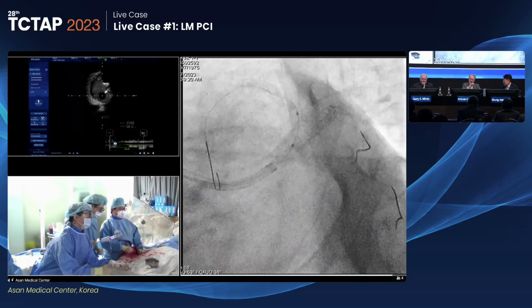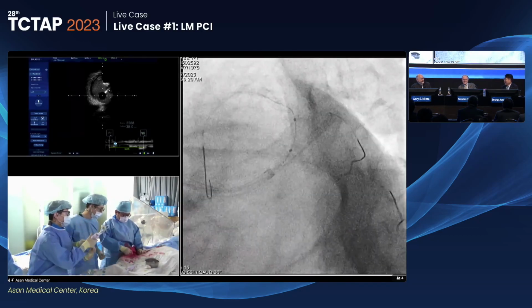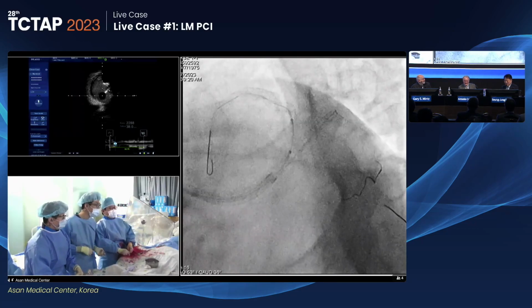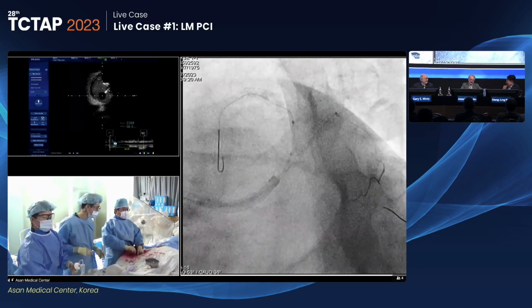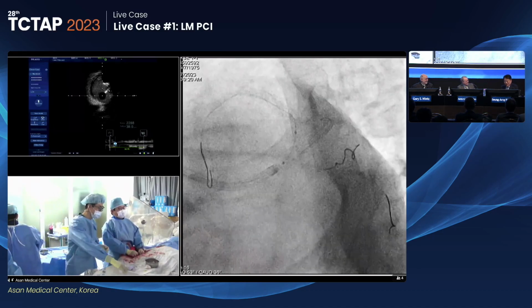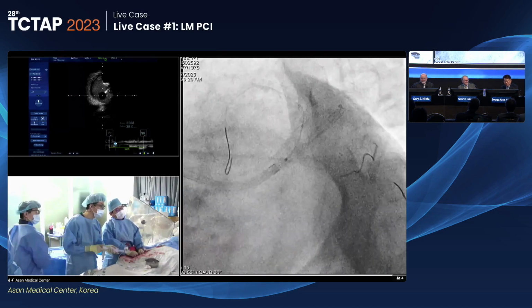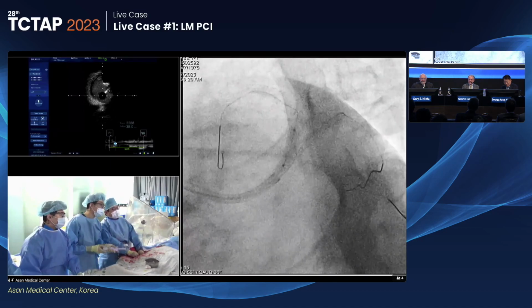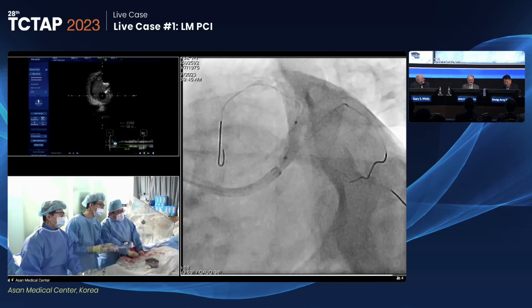This is old-fashioned PCI. I was about to say, isn't this what you did, Antonio, in the early 1990s? Yeah, that's what I did. This is old-fashioned. It's not old-fashioned, it's classic. An all-time classic. I think I remember getting a TCT award when you did a trifurcation.